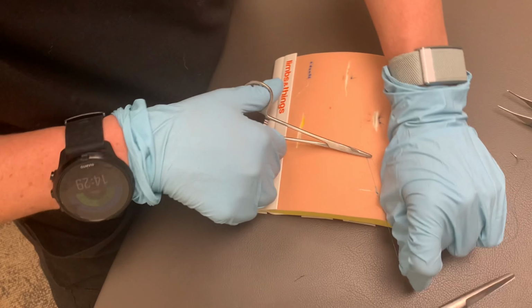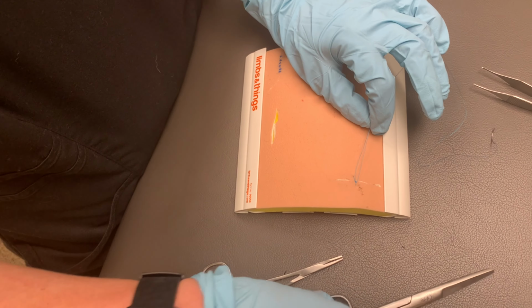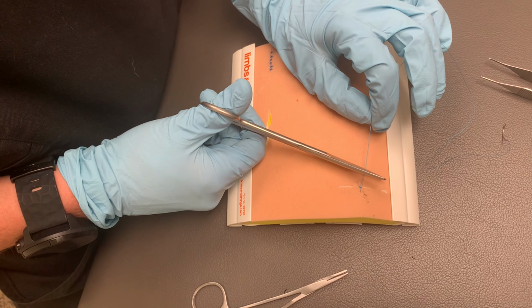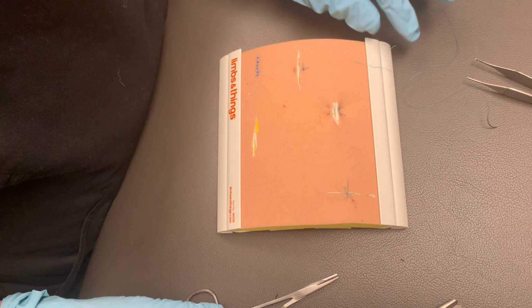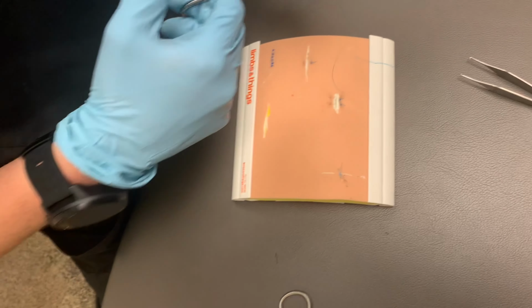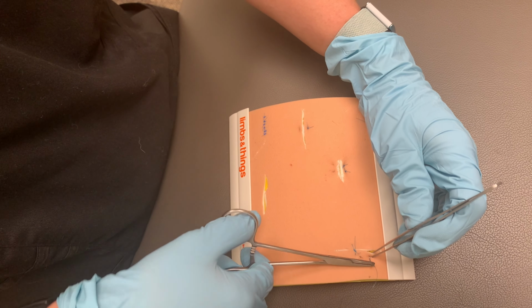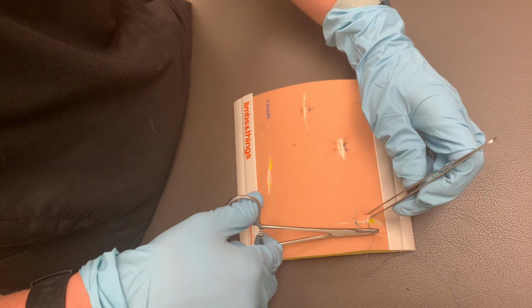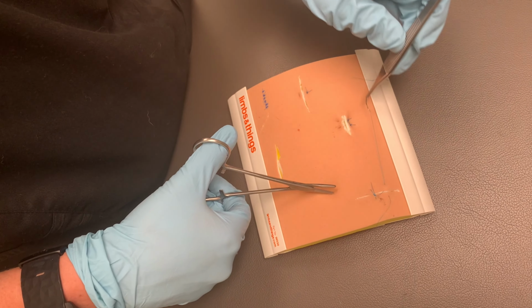Alicia placed her first suture in the center of the wound to help approximate and have good apposition of the wound. With this knot done, she's going to cut both the suture and the tail. And now she's going to place her second suture halfway between that first suture and one end of the laceration. She's repeating the steps she did earlier. And you can see that she's now halfway between that initial suture and the end of the laceration.